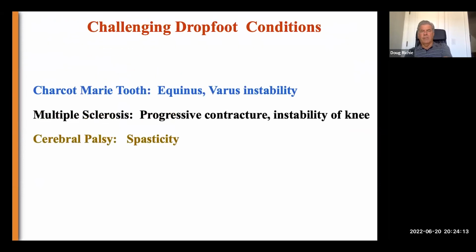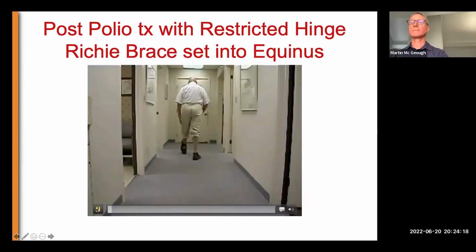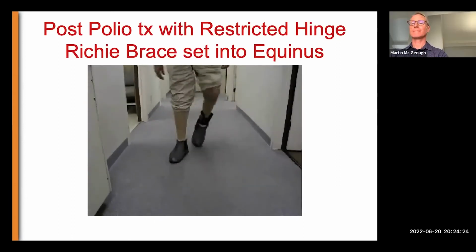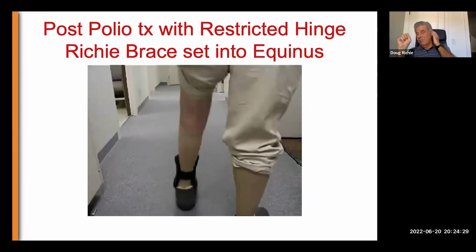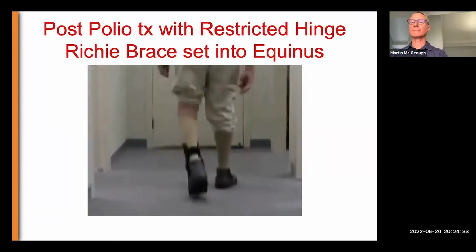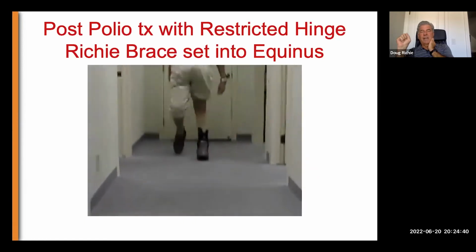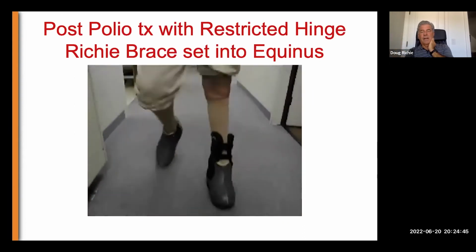Okay, so here's that guy walking now. And although he has a rocker bottom, this brace does a pretty good job of controlling his drop foot. You can see for now, he's heel striking. And he far prefers this brace to his solid shell AFO. Now, my criticism in this video is he doesn't have the back strap tight enough, and he's letting those limb uprights go too far forward on his leg, and he's losing some of the elastic recoil that he would normally get out of the brace.